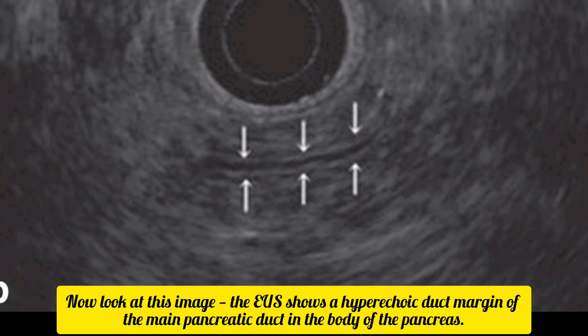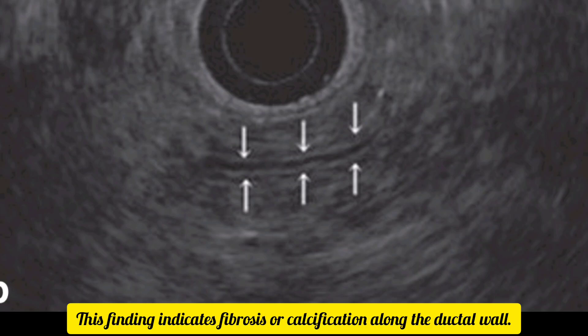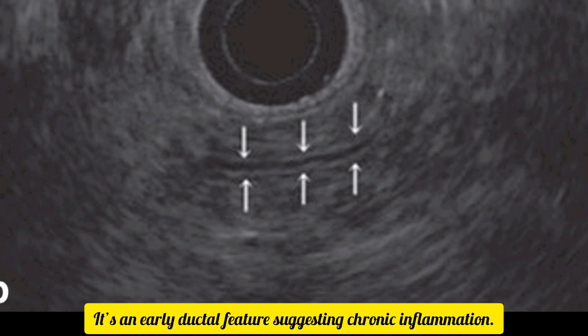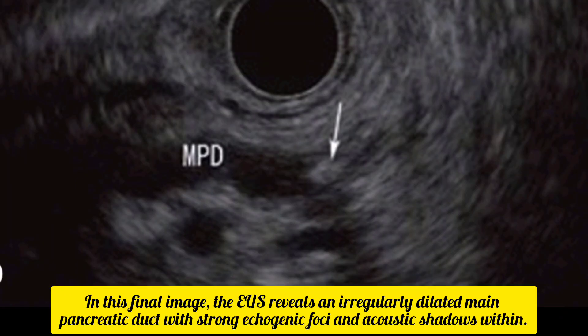Now look at this image. The EUS shows a hyperechoic duct margin of the main pancreatic duct in the body of the pancreas. This finding indicates fibrosis or calcification along the ductal wall. It's an early ductal feature, suggesting chronic inflammation.